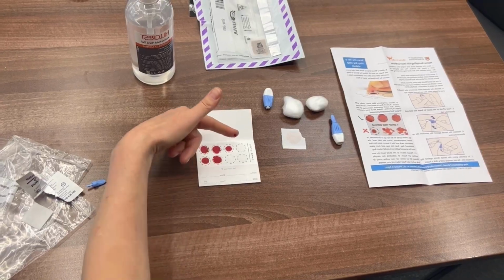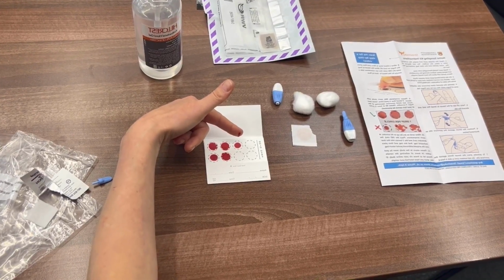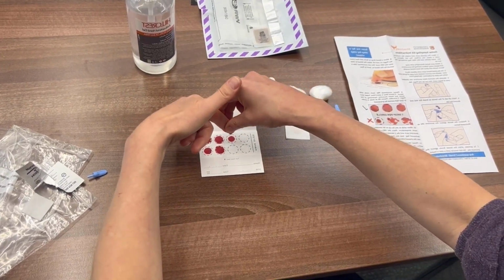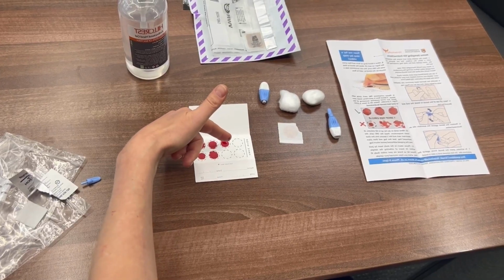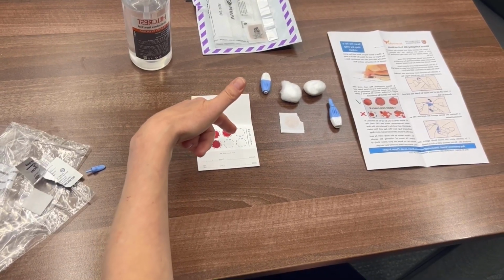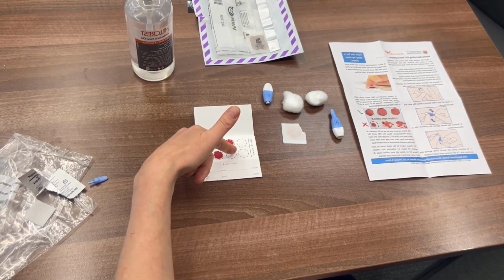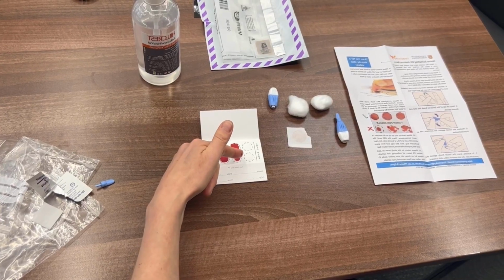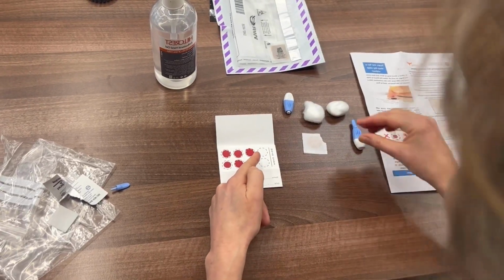Now, if possible, it's really good if we can get all 8 of these spots filled. And the reason why that is useful is, although it only takes a few spots to do your antibody test, it's useful if there's any problem in the laboratory to be able to repeat that test. And so everything that you give us will be saved, and we will be able to then reuse that spot if we need to do any further testing. So what I'll do is continue with that, but for the sake of this video, I'm going to assume that I have filled all of those spots.